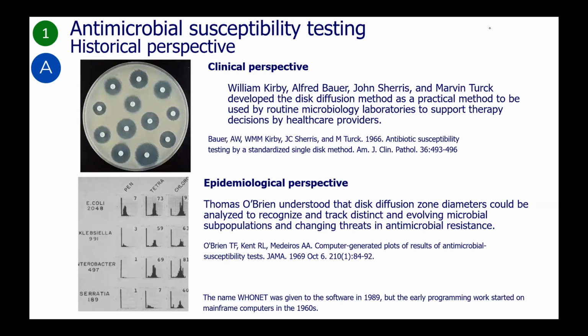The work that eventually became WHONET began in the 1960s. Recognizing the clinical impact of rising resistance on clinical outcomes around the world, Drs. Kirby, Bauer, Sherris, and Turk in Seattle developed the disk diffusion method as a practical method to be used by routine microbiology laboratories to support day-to-day therapy decisions by healthcare providers.